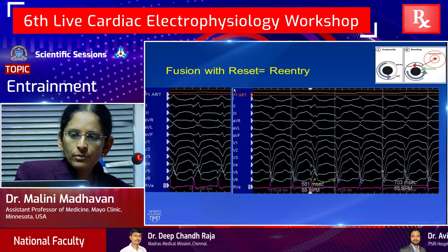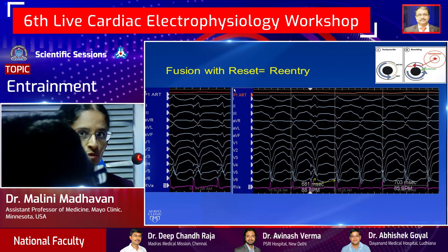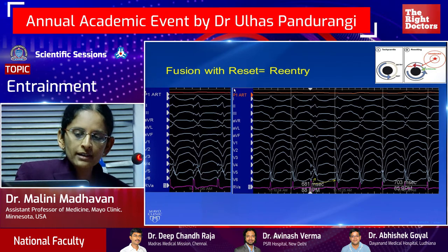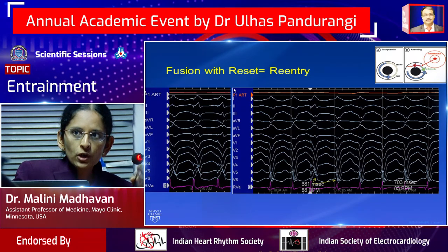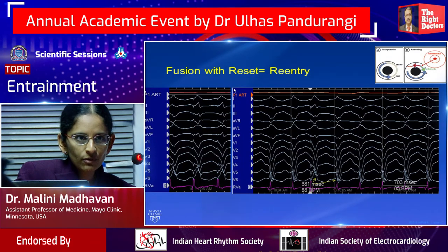So we'll see an example of that. Before you do any of these maneuvers, some of the baseline things you want to do is you want to know what tachycardia looks like, which you have already induced. But before that, you want to know what pure pacing looks like. Otherwise, you won't know what the fusion between pacing and tachycardia would look like, right?